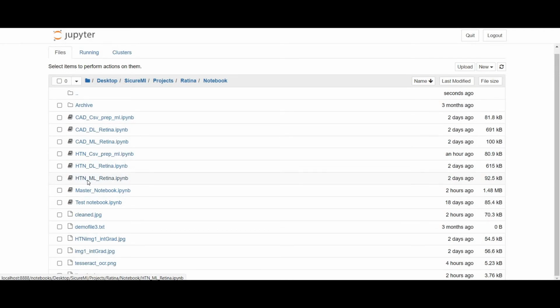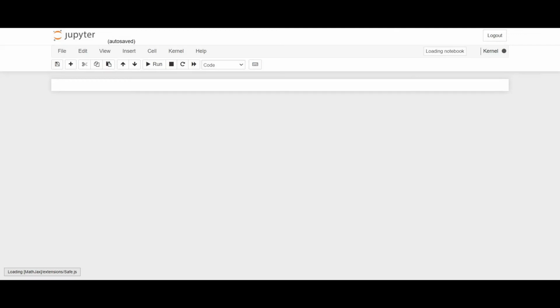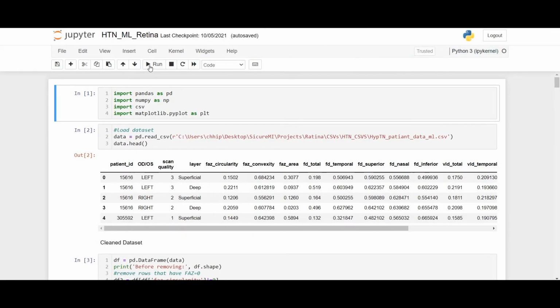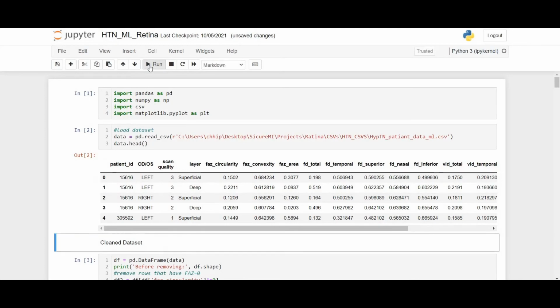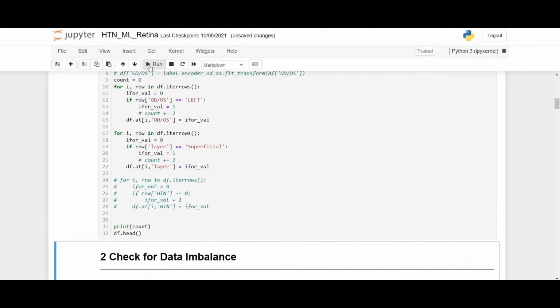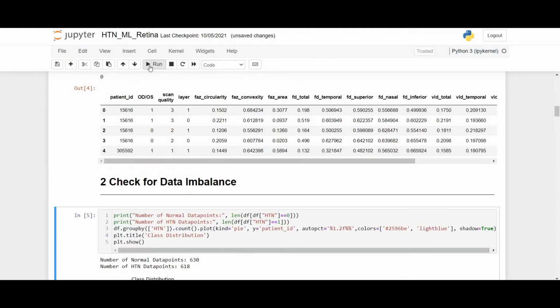Now we are going to train our machine learning model. To train the ML model we are going to run the htn_ml_retina notebook. First we are going to load the hypertension final patient data ML CSV file, and for pre-processing we are going to remove the data where FAZ circularity is 0. Then we are going to check for the class imbalance in the dataset.